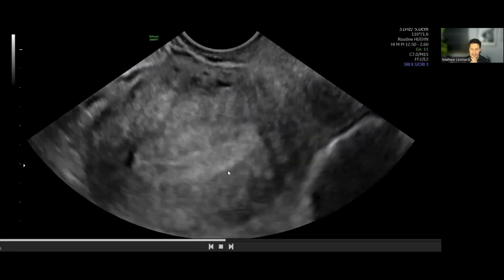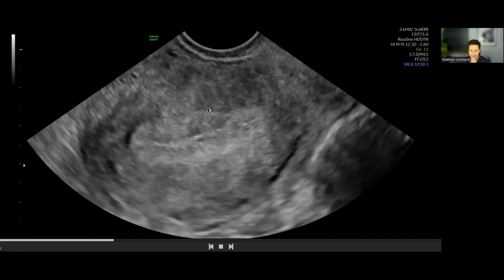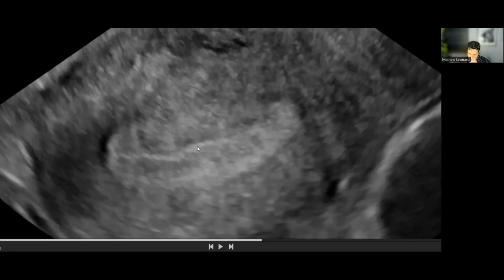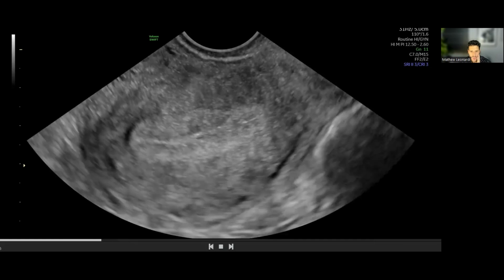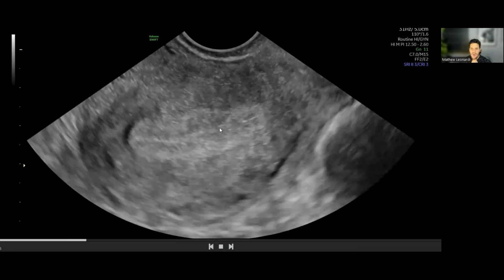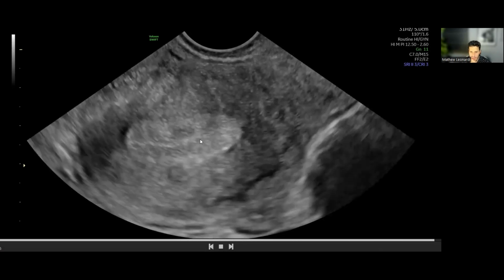Okay, so here we go again. Here's that technique where we can apply pressure and see if we can achieve sliding between structures. And so very subtle. I'm gonna zoom this up here. And then I'm gonna push play again. Will it play if I zoom it up? Not quite. Maybe if I do this. So what we're seeing, it'll be a bit back and forth here. But in this region here, in any case, what we're seeing is definitely some sliding from the posterior to the anterior. And so that might indicate here that we do indeed have a little polyp in this region.